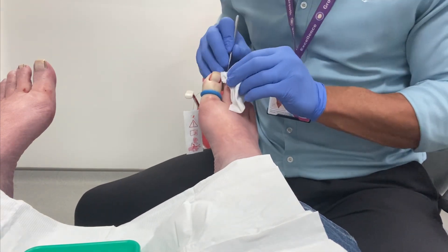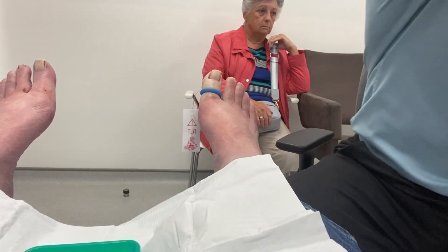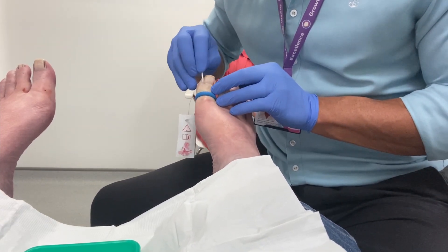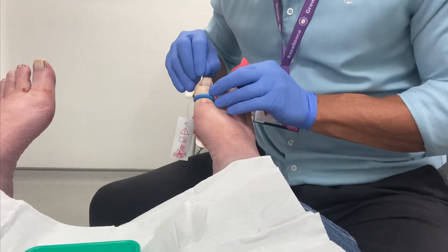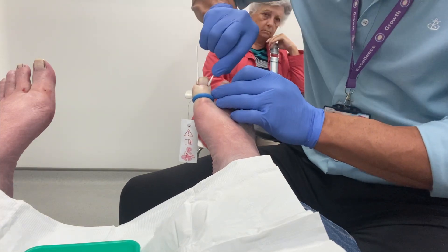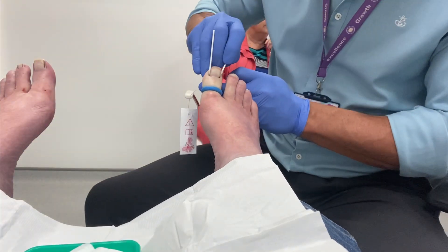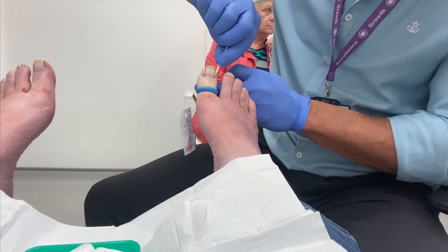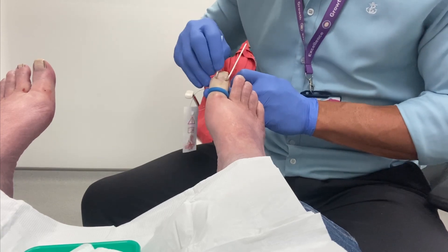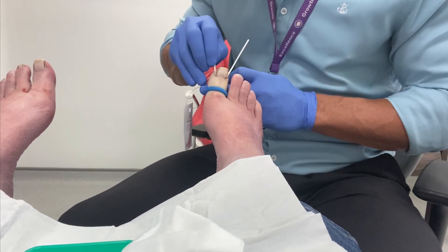We just check that all the nail plate has been removed from both sulci. We remove any blood, which prevents the phenol working when we are chemical ablating the nail bed, and then we apply the phenol. We are looking here for a change in colour primarily to the tissue - both sulci. The tissue turns from a red-pink colour to a grey colour, and this also helps prevent bleeding as well as preventing the ingrowing portion of the nail from returning.